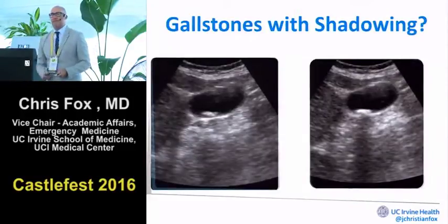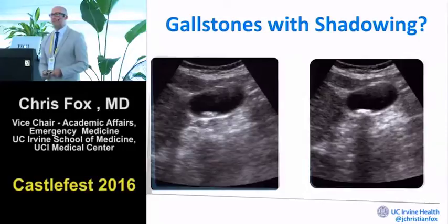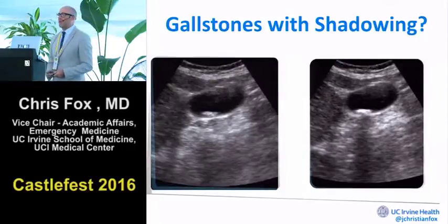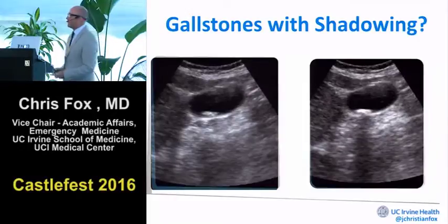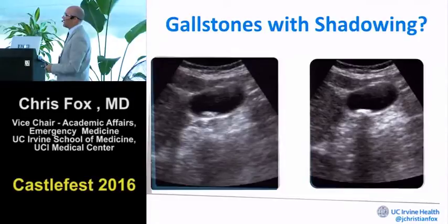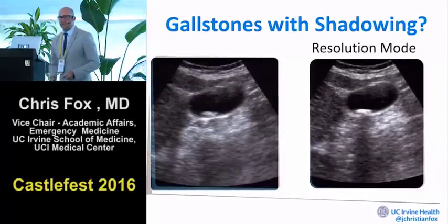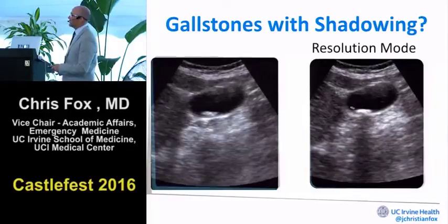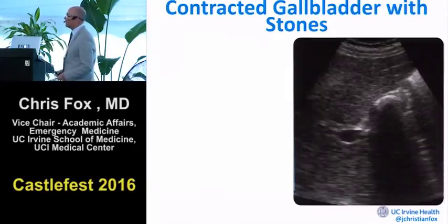This is the same patient, little technique here. What do we do differently in that image on the right? Because we want to see the gallstone shadow, right? What did we do to the machine? We clicked a button. Any ideas? If you look here, the sound got attenuated more. It didn't go past the gallbladder. So if we want that sound to attenuate more, we could turn up the frequency, go to the resolution mode on some of the machines. That's what they call it. Or just hit your frequency button, bump it up a little bit, and you're like, oh, okay, that's totally a stone. It's shadowing now. So that's a little trick there to get that shadow to come out.